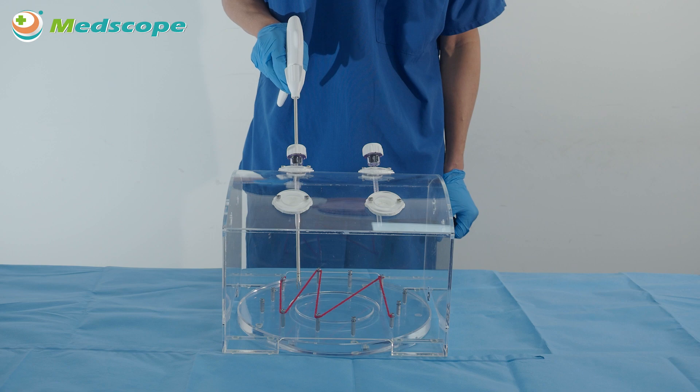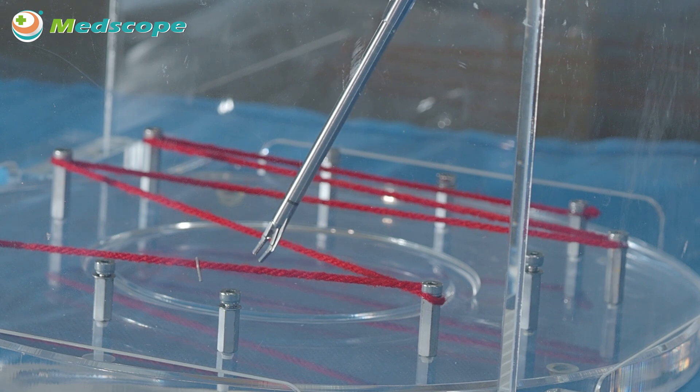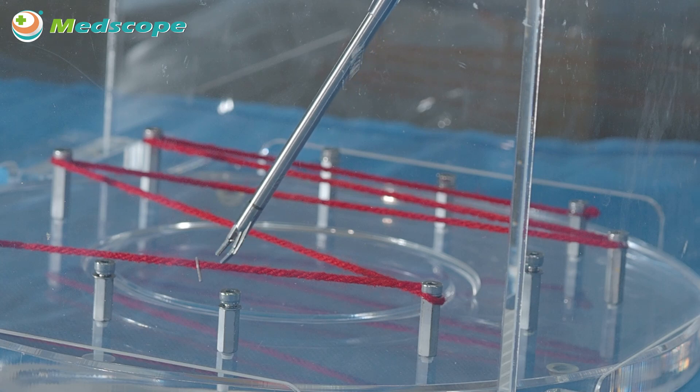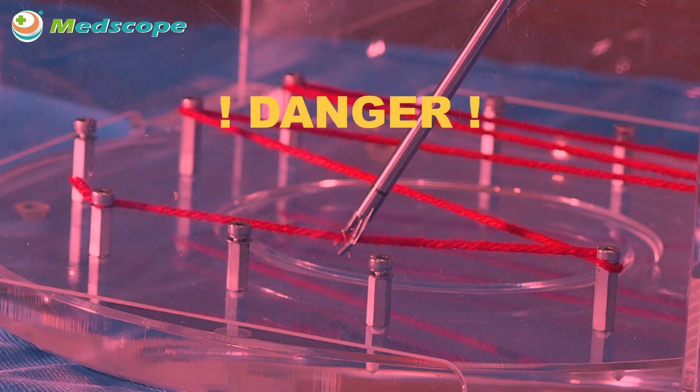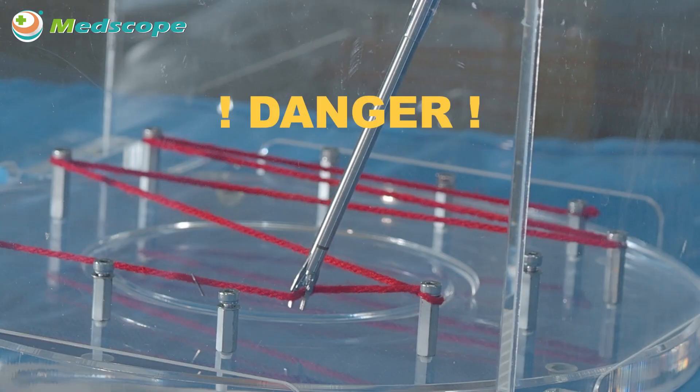Prior to squeezing the trigger to place a clip, visually confirm that the clip is positioned free of other clips and obstructions. Firing a clip over another clip may result in malformation of clips, which may cause lack of hemostasis or damage the jaw.